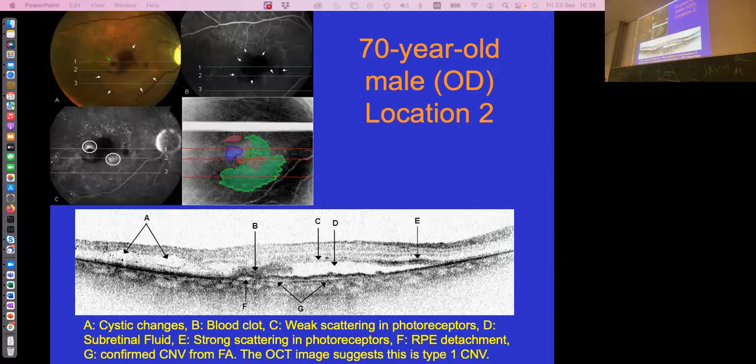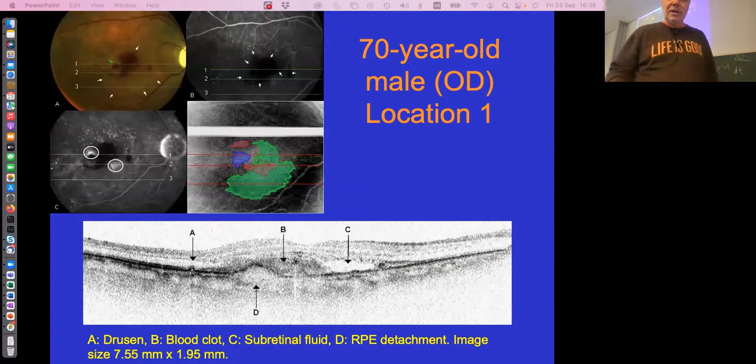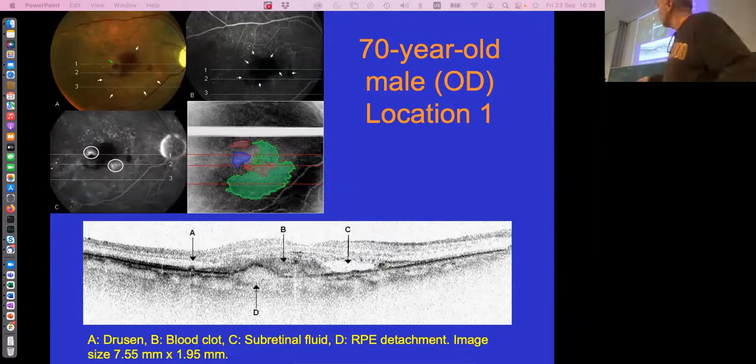And the problem is that this blood vessel layer should not be there. It is weak and leaks, and that leads to these fluid membranes and all kinds of leaking blood and blood clots in the retina, and that is then causing blindness. If this persists, these photoreceptors will die. What you may not realize is this is right at the fovea. To go back, you might be able to recognize, you really see that dip. Remember that dip that is occurring, and right at the dip, you have a tremendous blood clot. So this person has serious problems with his vision.